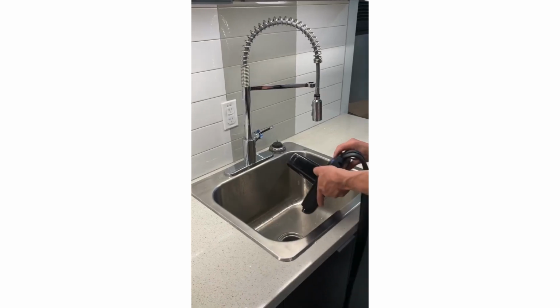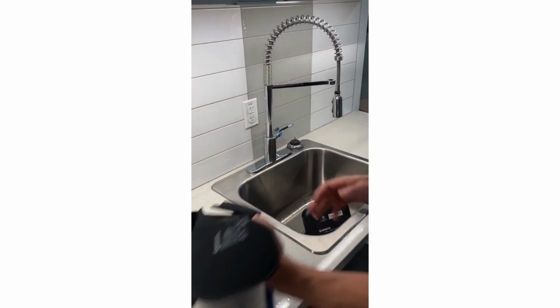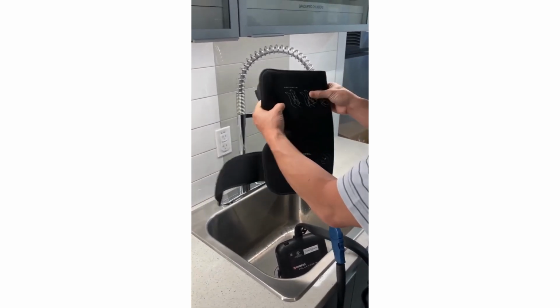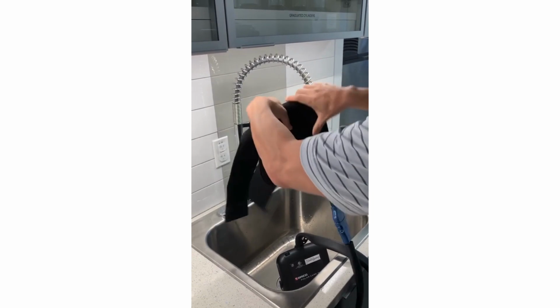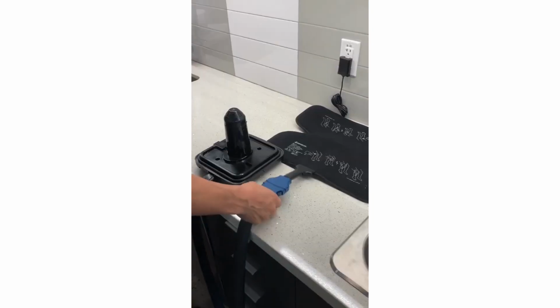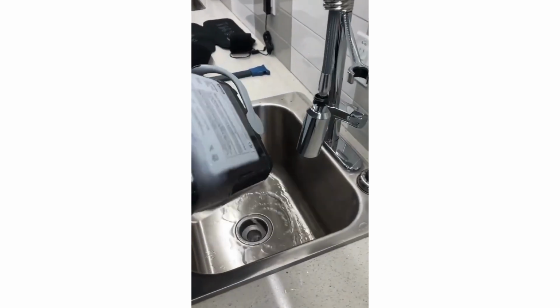Place the lid assembly in a sink and drain while it is still connected to the pad. Raise the pad over the lid assembly and let gravity drain the pad. Fold the pad in half and roll it up to push the remaining water out of the pad. Disconnect the pad and pour the water out of the unit.